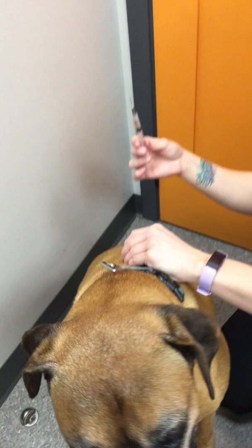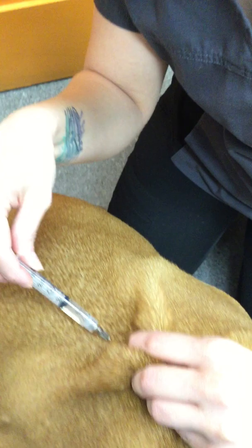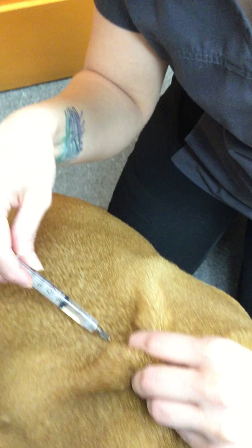What you're going to do is grab part of his skin and make a skin tent like this. I usually use my index finger to just make a little tent. Then you're going to poke right at the base there. Release your skin tent, then pull back a little bit and make sure you don't get any blood — if you get bubbles, that's normal. Then you're going to inject. I usually put my finger over there just to make sure it stays in and there's no blood. And that's it.